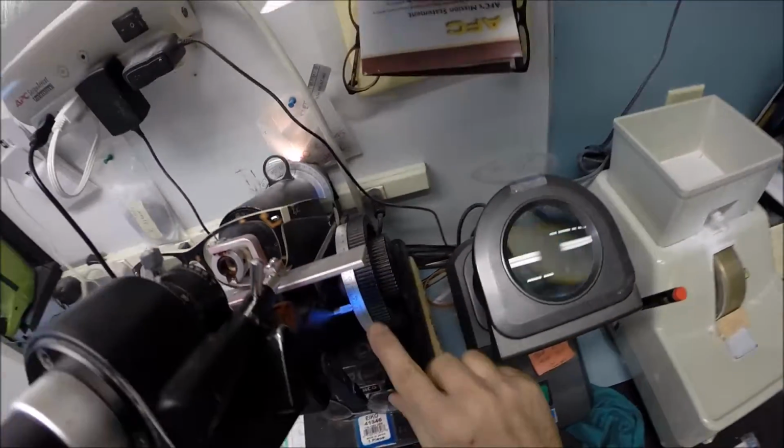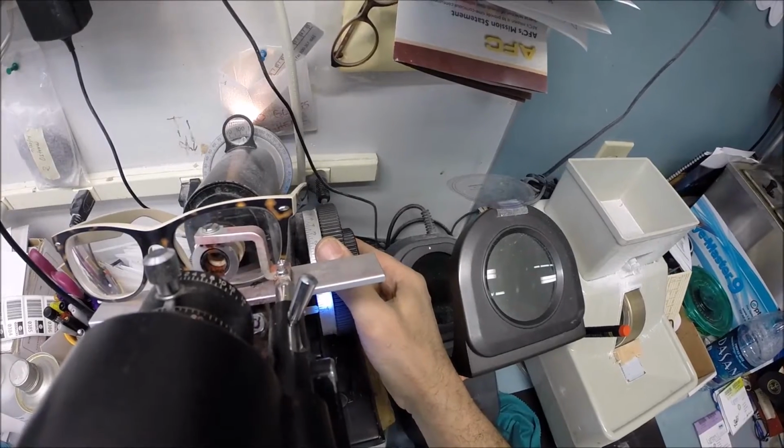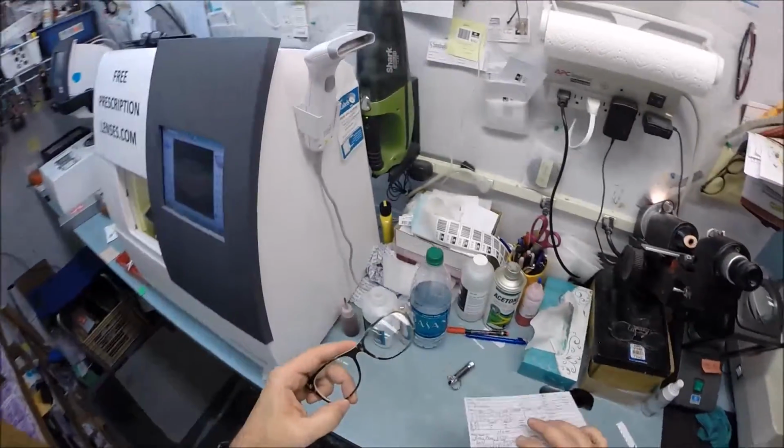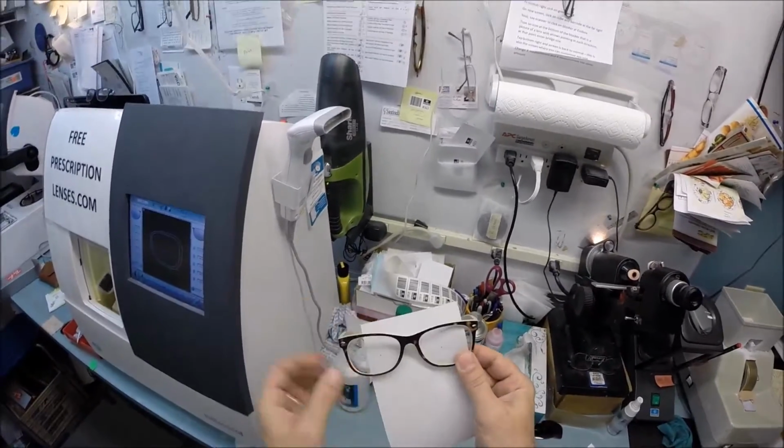Turn the power until I read minus 275. Check your astigmatism correction. That's right, the squinting machine. And we're at minus 375, so that is made correctly. That couldn't be made any more correctly if I had done it myself. Now I'm going to check your pupillary distance, which is 60.